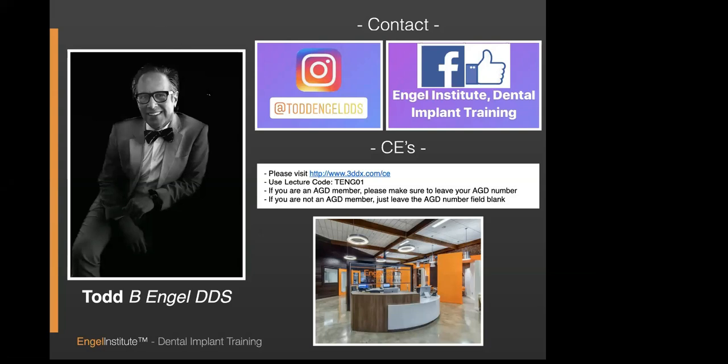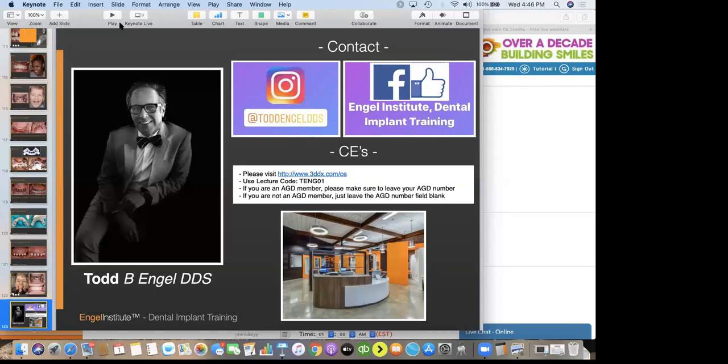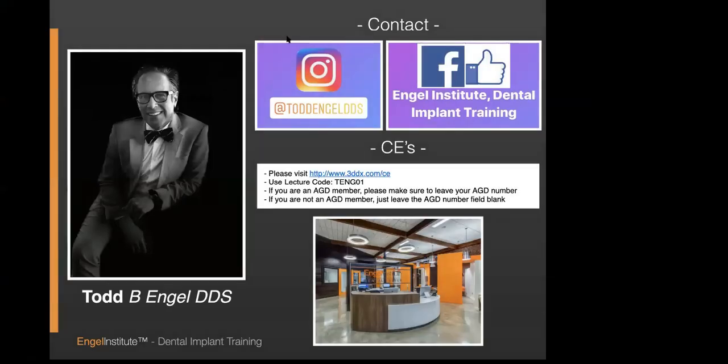Frank, we're going to do Q&A now, buddy, if you want to take over. Dr. Engel, fantastic lecture. Thank you so much. A few Q&A for you. First of all, a couple of questions regarding which reline material do you usually use, and which denture marker beads do you usually use for your dual scans?